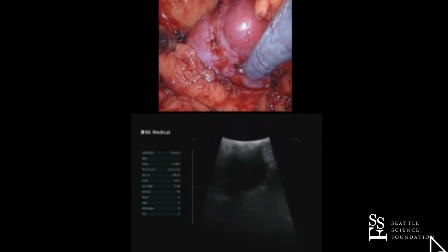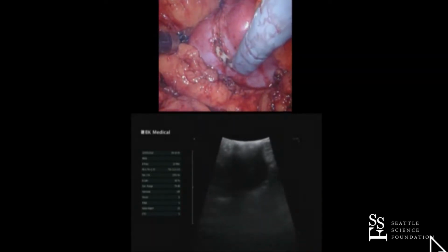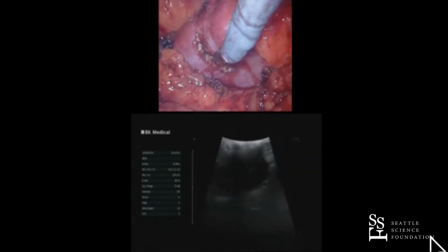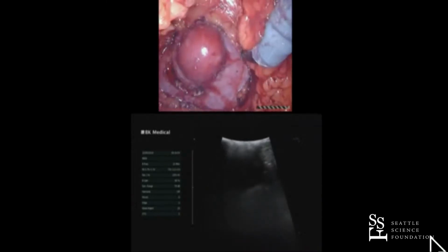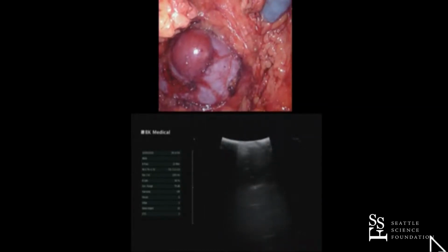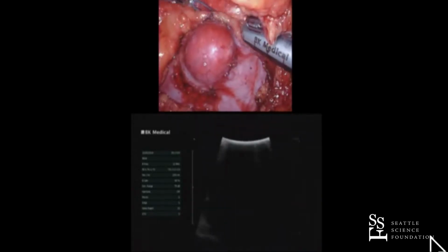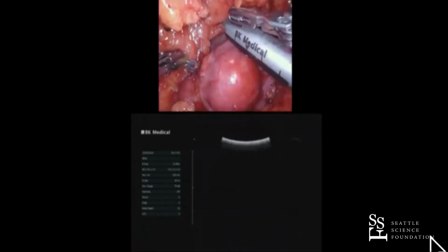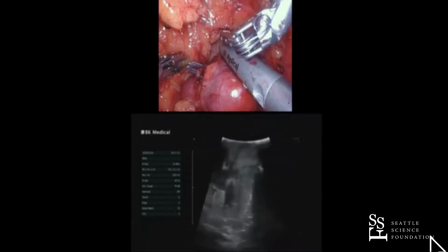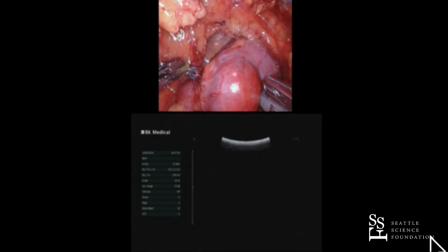So here's my first mark. I made a mark down here with the ultrasound so I can just connect those two. And again, I agree with Ronnie. Cancer control is really what this operation's about. I do enucleations in certain cases, there's no question. Some of those cases are tumors that are right on the hilum, and you have to enucleate. But in general, when you have a peripheral tumor like this, I'm going to pull back. So the tumor is meeting us right about there. Tumor is right there. So I'm going to get a little farther away.